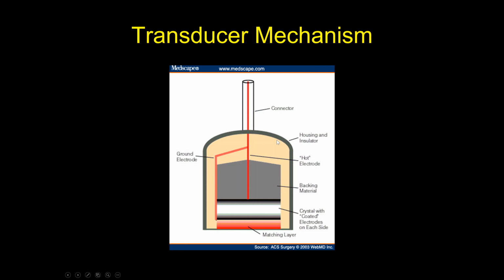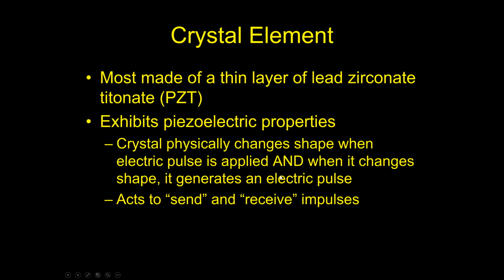Around the crystal, I have the plastic housing, and then in the front is this matching layer, which is that gray area you saw in the real probes a minute ago. And this is where the sound comes out. So that's kind of what's inside one of these probes.